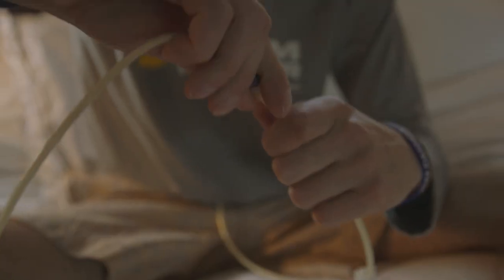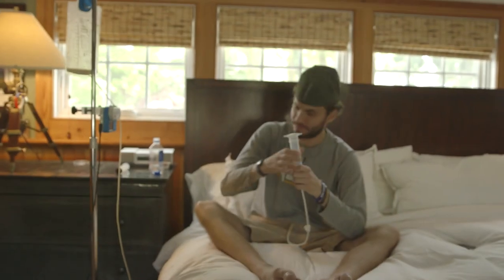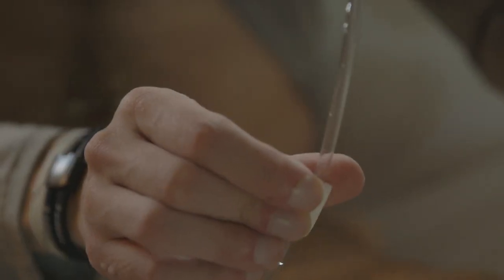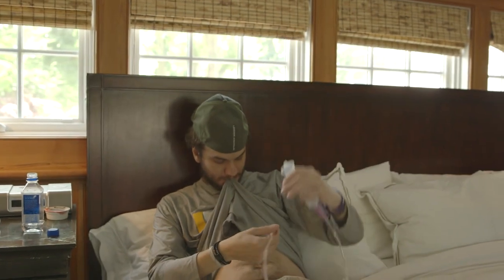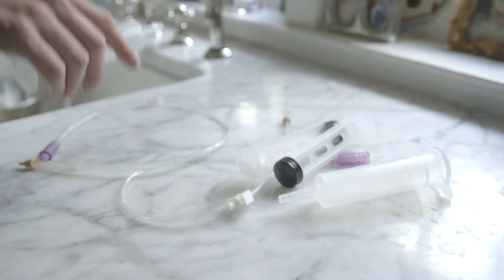Once complete, disconnect the pump. Use a syringe to flush the extension set with water. Clamp the extension set, disconnect, and close the button. The ENfit connector system is designed to improve patient safety by reducing the risk of misconnections.